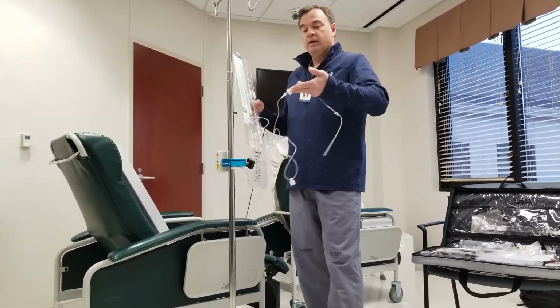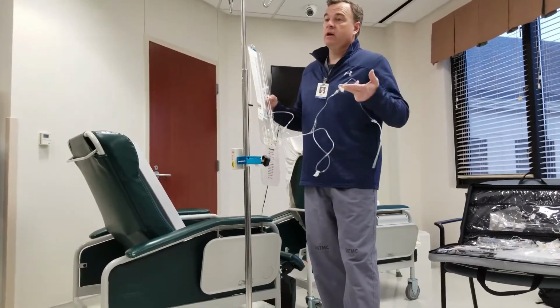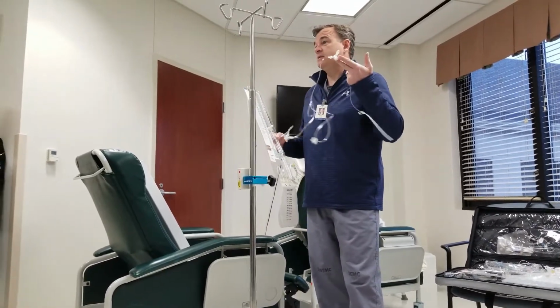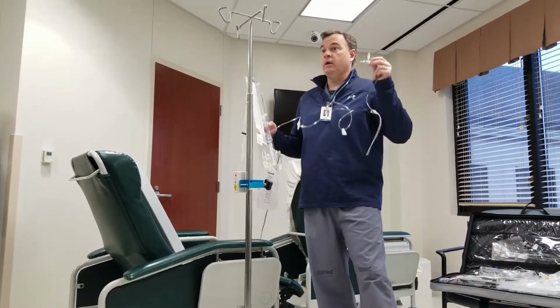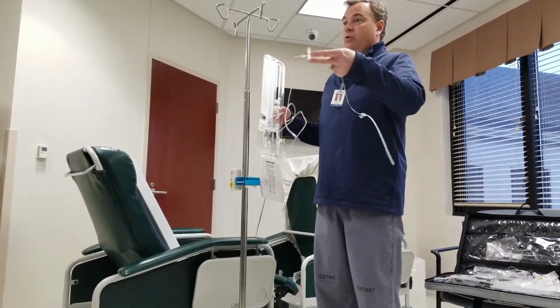But in general, this should jump out at you, because what you want to avoid is you're working a double, you're tired, there's a bird's nest of tubing, you're pushing meds, and you inadvertently push this, and that's a CSF pathway, and that's a life-changing moment for a variety of people, right? So this should jump out at you at all times.